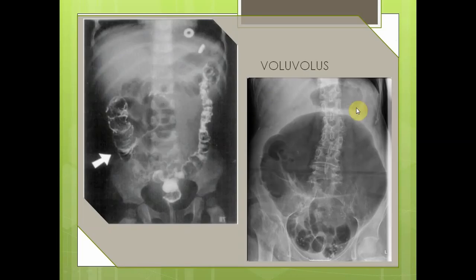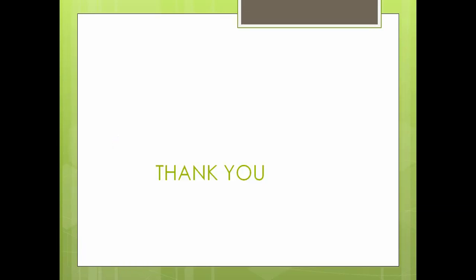So this is another indication. You can see such a large bowel here. This is one of the indications. Here you can also make out with all this white. What you can see is barium, a large intestine barium study, which we call barium enema. All this barium is injected through the anus. So in the large bowel, this is the sigmoid colon, this is the anus, this is the descending colon, and this is the ascending colon. See, the ascending colon is so large, it means there is distension with bowel gas.